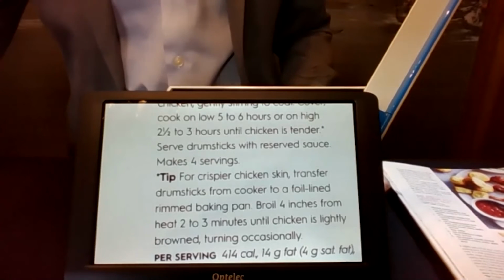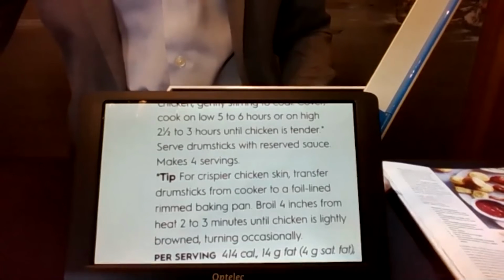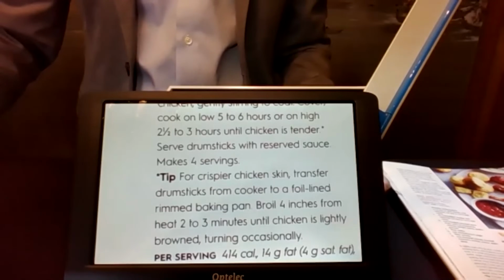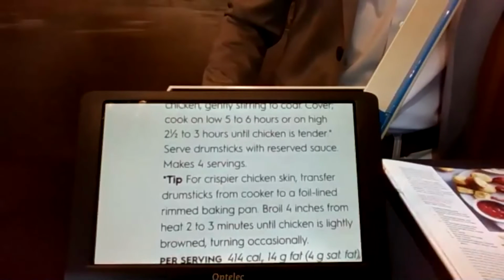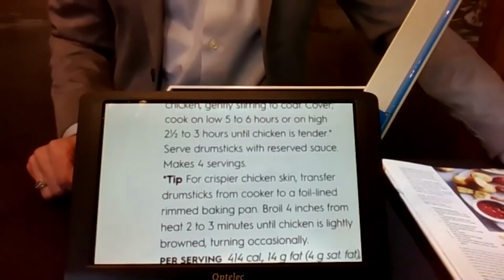You just simply press the pen if you want to write under it. That ensures the focus is on the paper and not on your hand. Otherwise, as your hand moves under the camera, it's going to focus on the top of your hand, which means what you're actually trying to look at is going to be blurry. It's just small details like that that are so meaningful for the people that use these things.